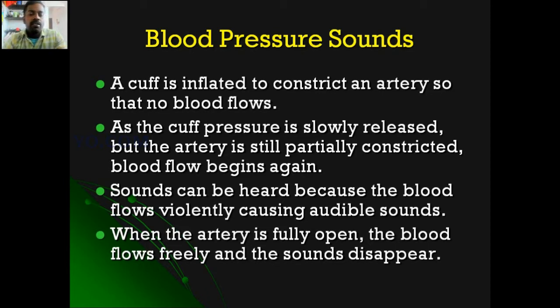What is a cuff? When measuring blood pressure, the doctor or nurse places a layer, called a cuff, over the arm. Initially the cuff is empty, and after that they increase the pressure by filling air by pressing the bulb.